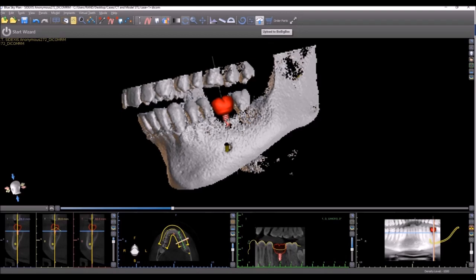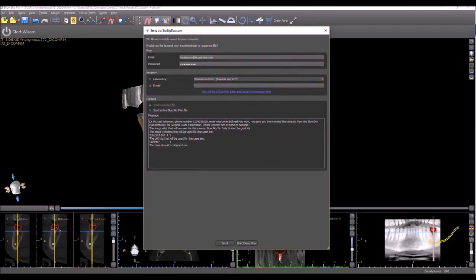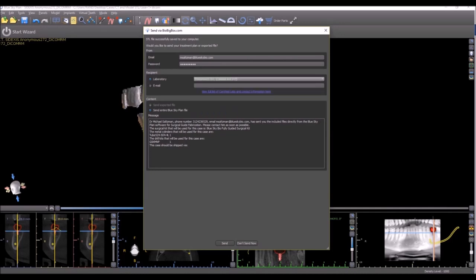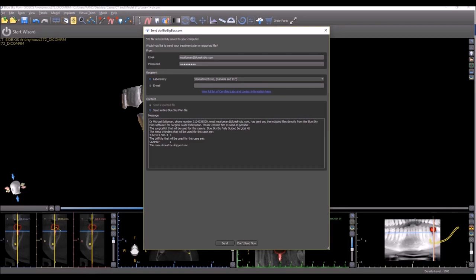We have also improved the send interface via BioBigBox. Here you can see that you can either choose a laboratory from the drop-down list without even needing to know their email address, or you can choose to just enter an email address for anybody and send the case or the exported file to the recipient directly from within Blue Sky Plan. Your email address, your login details for BioBigBox appear on the top of the screen, and it will send via your login details for BioBigBox.